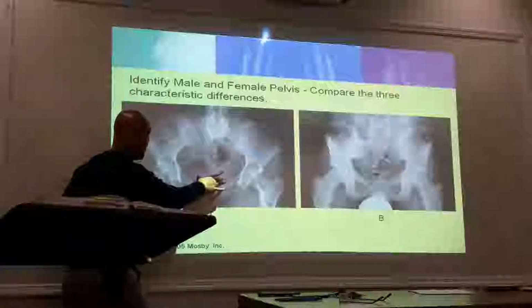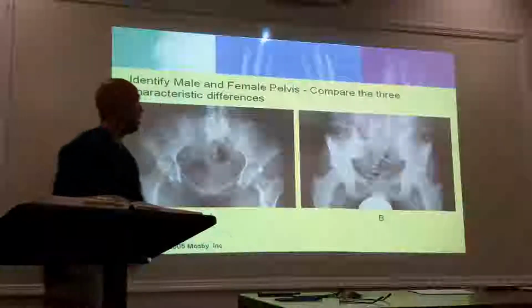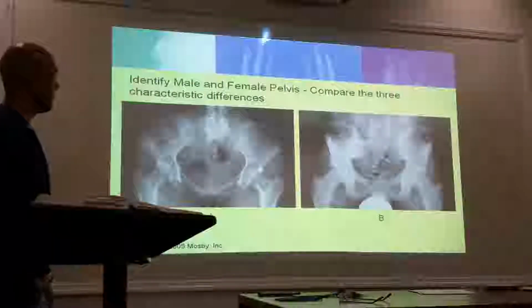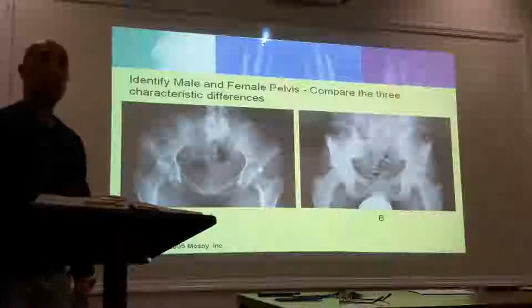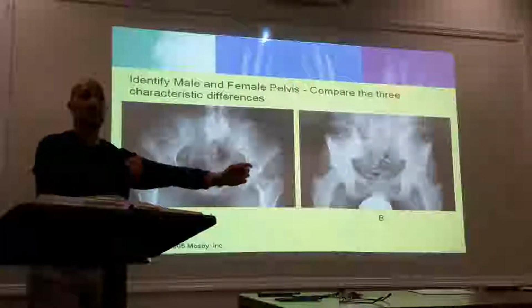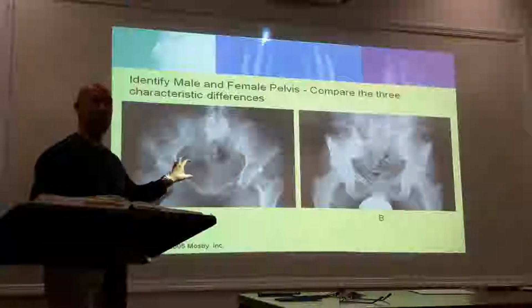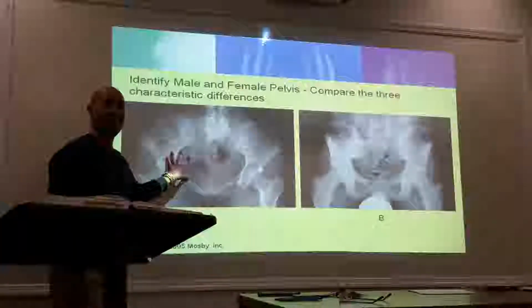So what is that? Bladder? Your urinary bladder. What if you're trying to view the coccyx though? Like, what if there's a fracture? Okay, so one of the preps that we do for a coccyx is that the patient has to empty their colon. That's one of the criteria, patient prep.